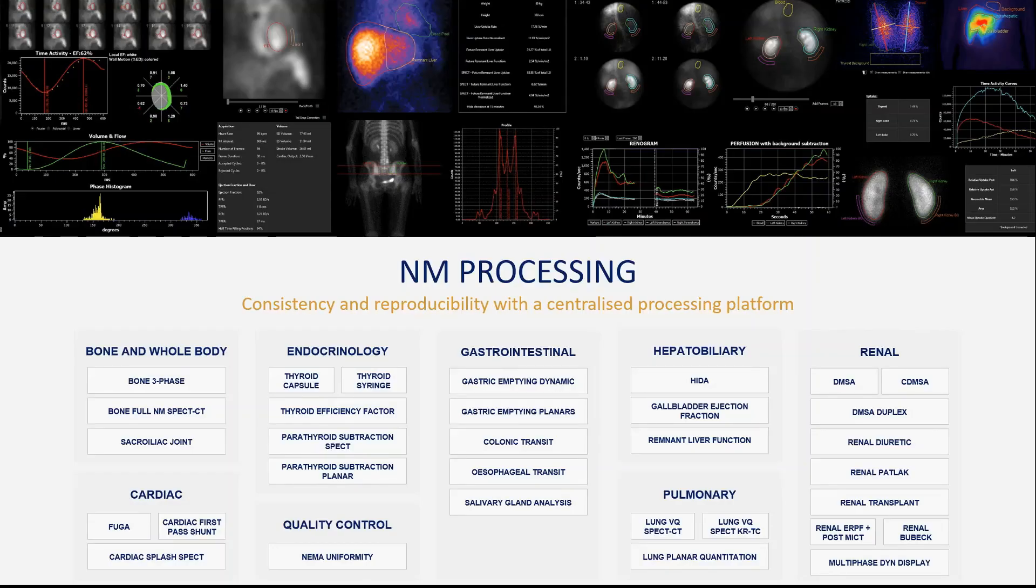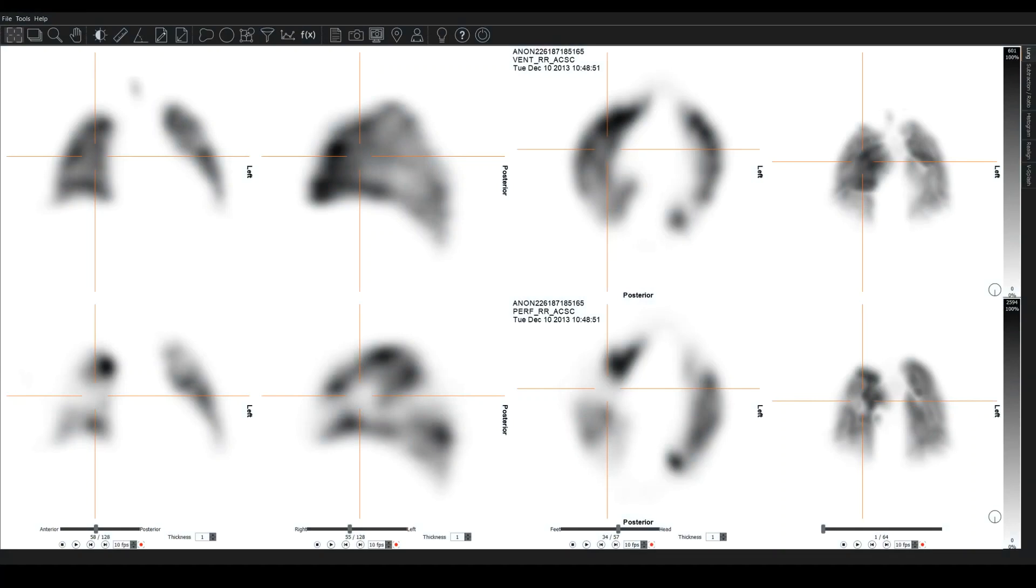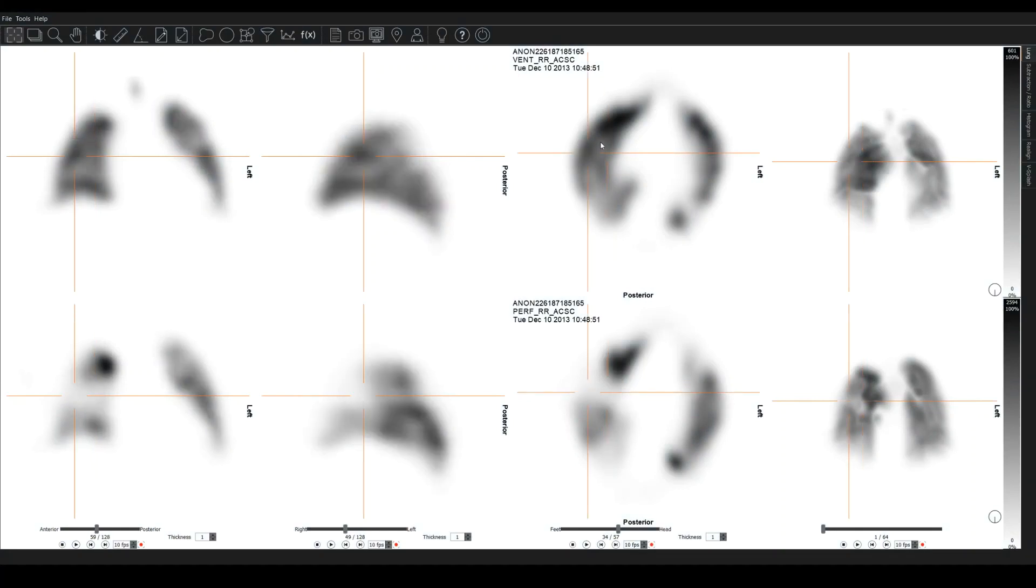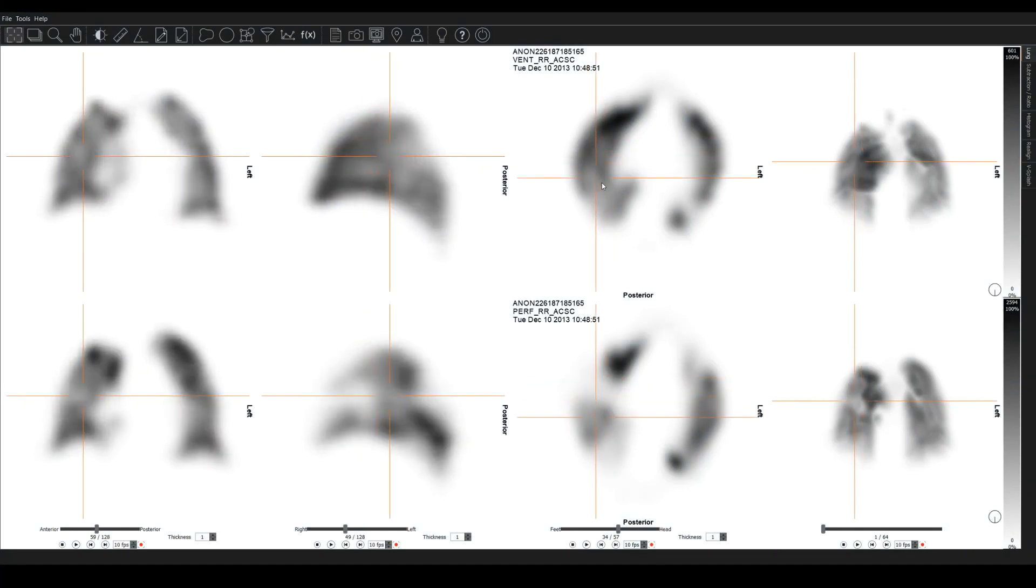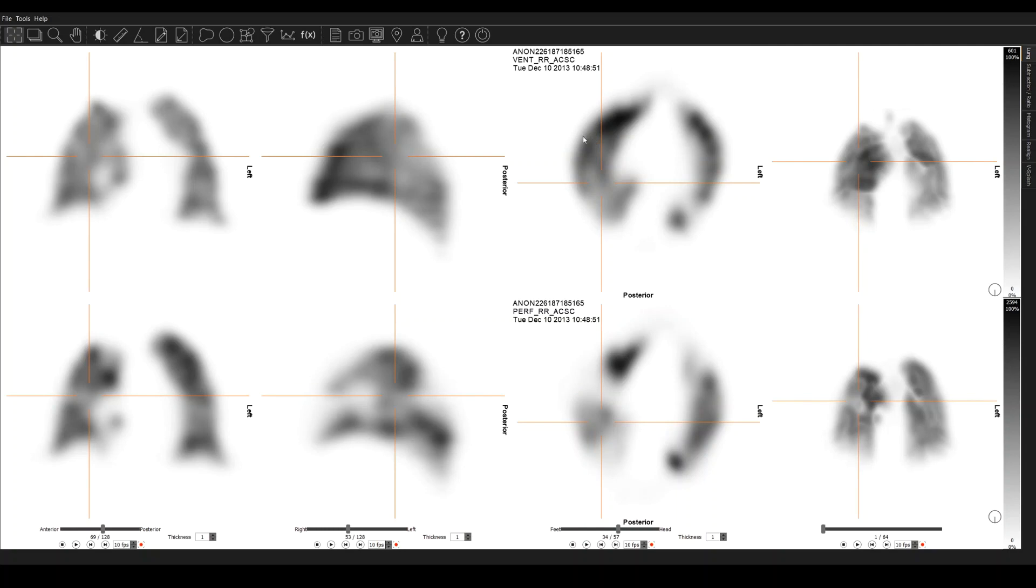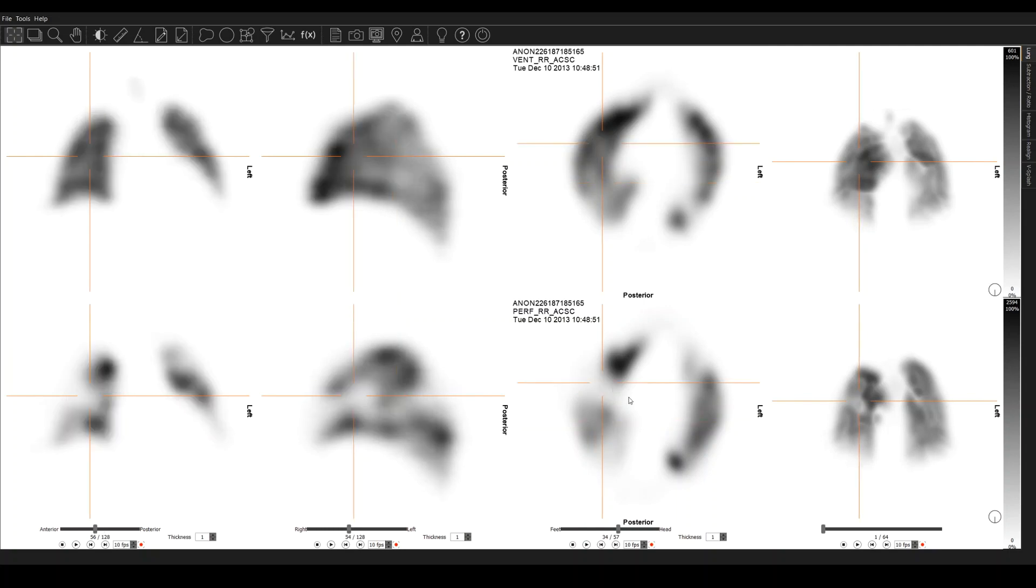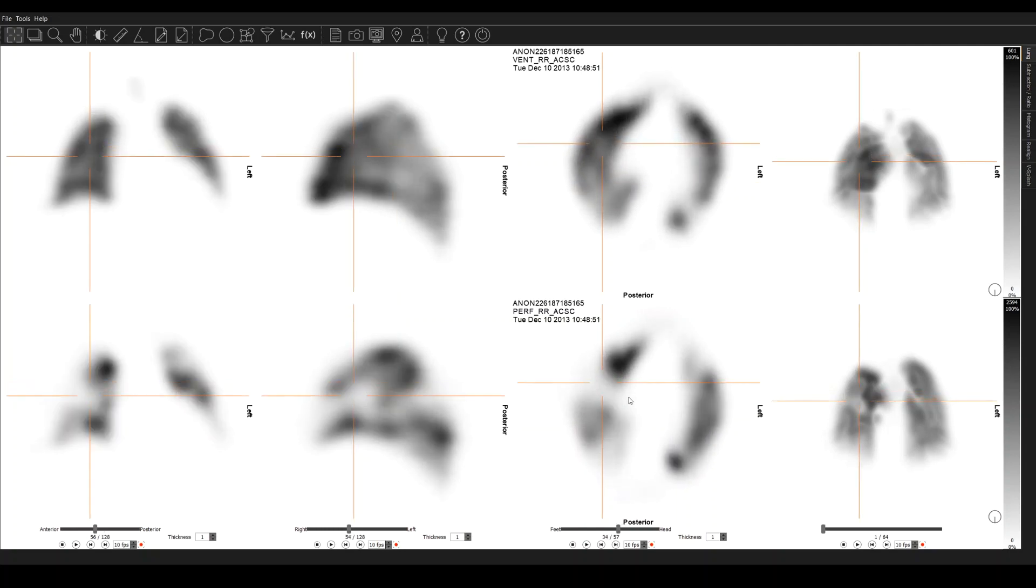For lung VQ SPECT, we can take in the images, automatically align them, and then you can triangulate through the slices here. So we've got ventilation on top, perfusion on the bottom. So we can scroll and triangulate here to find the defects, the mismatches.